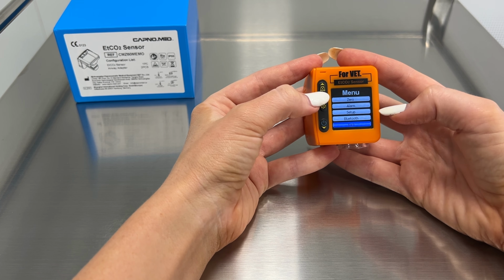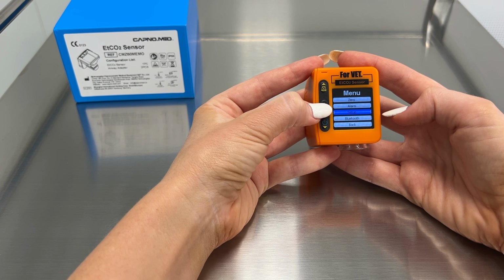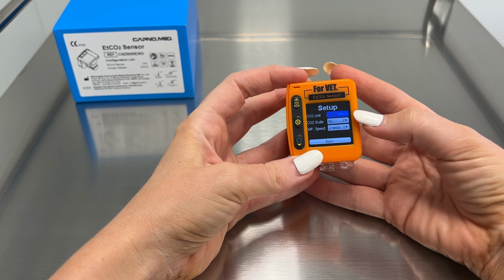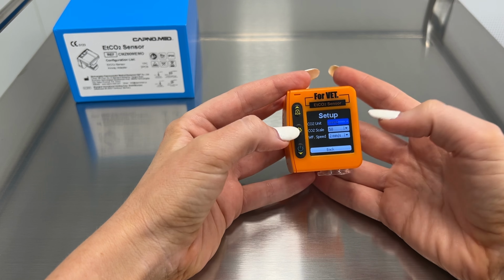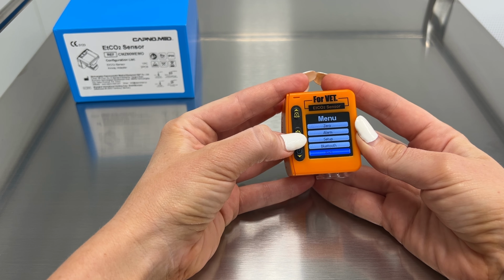So now I'm going to go to setup. So I'm just going to go up in the arrows and select setup, menu to select. This is just looking at the different kind of measurements. So it's set as millimeters of mercury, which I want to keep it at that. So I wouldn't adjust any of these settings, just keep them as the stock kind of settings that are there. So I'm going to go down to back.